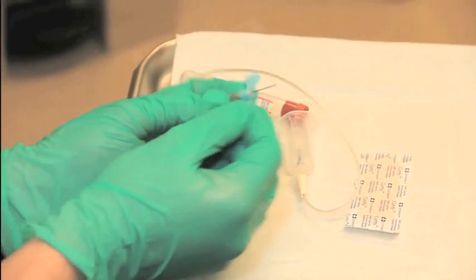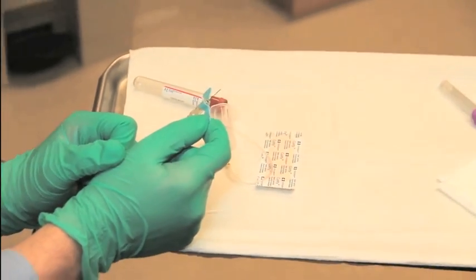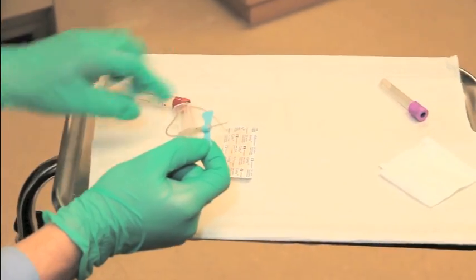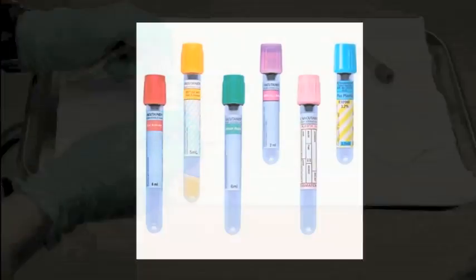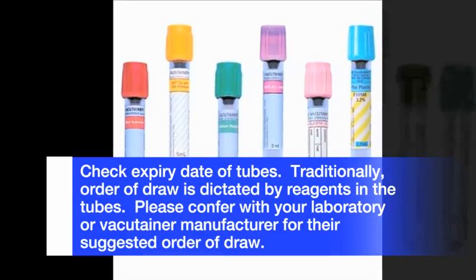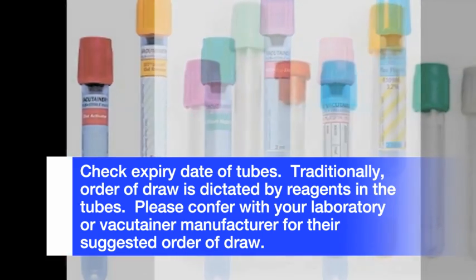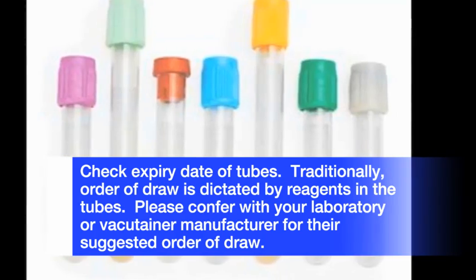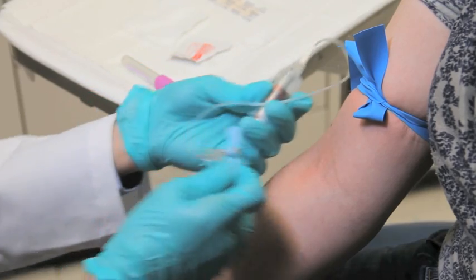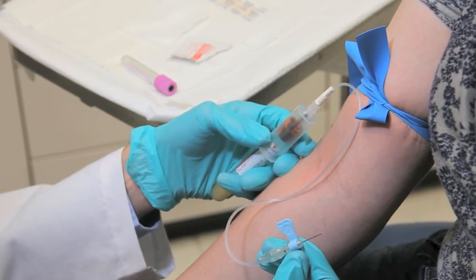Once you identify your target vein, grasp the right wing of the butterfly and your right index finger and thumb with the bevel up. Hold the vacutainer adapter and your first empty tube in your left hand. The number of tubes that need to be filled depends on the type of blood test you will be running. Tubes should be filled in order, starting with your highest priority test first in case you cannot get additional blood. The vacutainer should be loosely in the adapter ready to be punctured, but do not puncture it just yet.